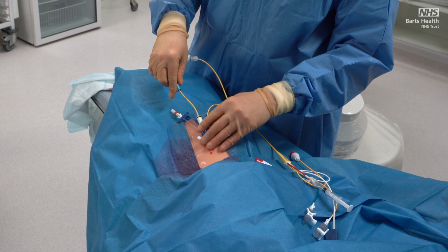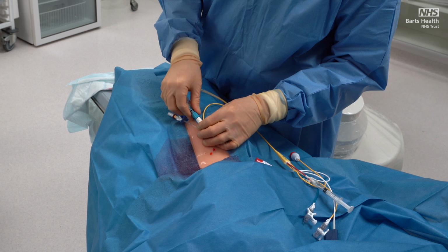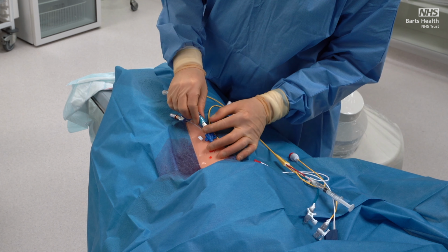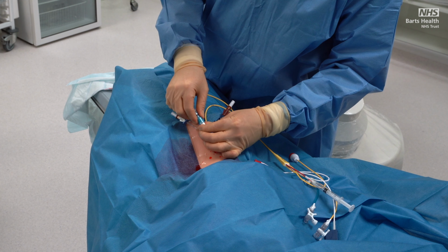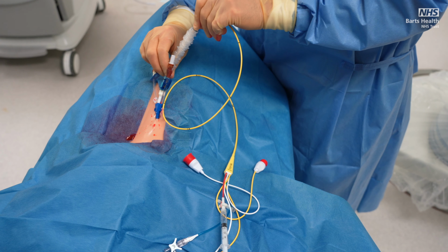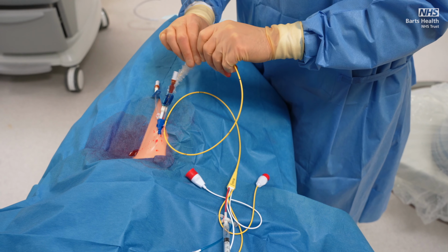Connect the protective sheath onto the top of the catheter so that you can handle the rest of the device sterilely. Open this out to be able to see the markings.